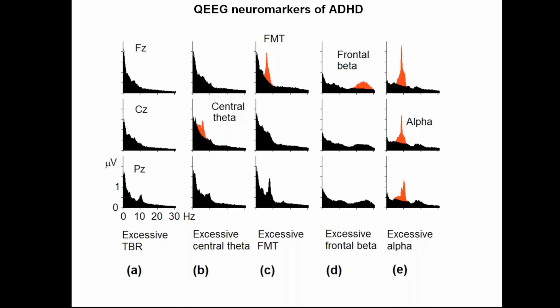But again and again, I have to stress here that when you look at the EEG spectra, you are looking at a relatively narrow window to the brain, and you can tell how the cortex in this particular subject is self-regulated.